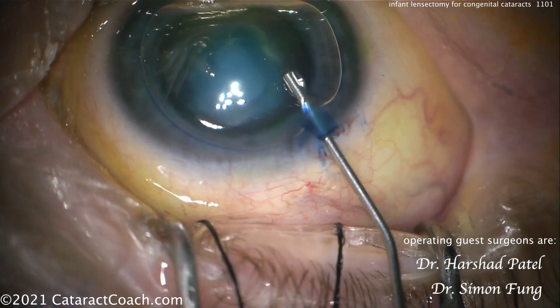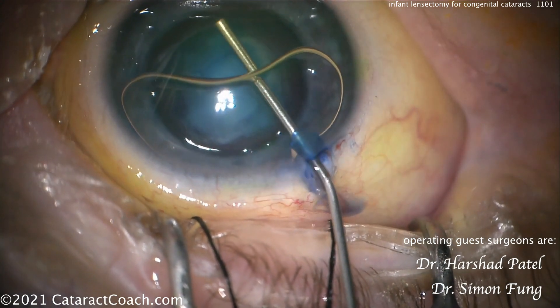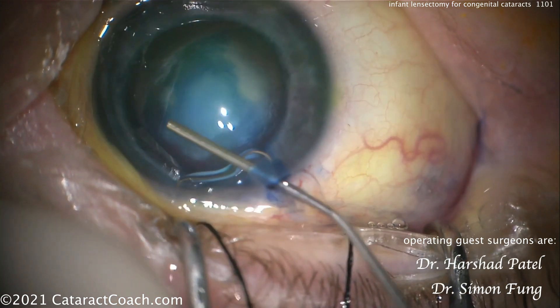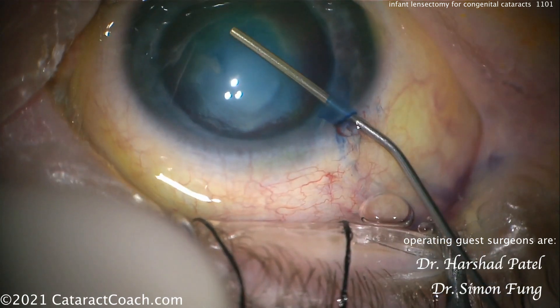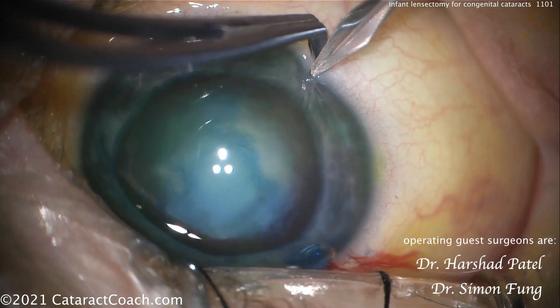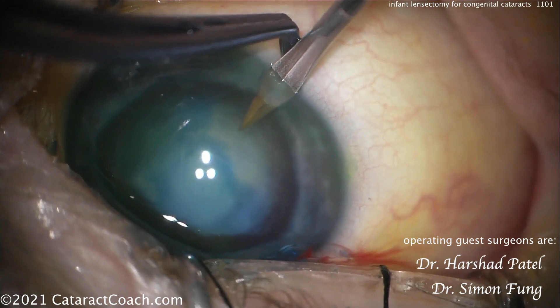Trypan blue dye using an air bubble as well — nice technique. The trypan blue dye obviously will help with visualization, but also importantly it does make the capsule a little bit less elastic. Otherwise these capsules are very elastic. Now the viscoelastic going inside — that looks really good. You can see there's a reasonable stain there of the anterior lens capsule with that trypan blue dye.